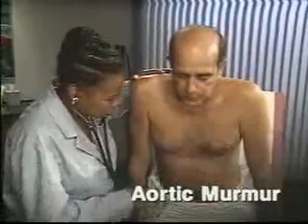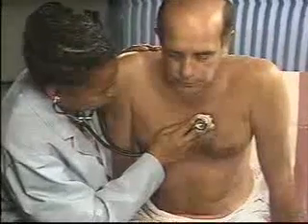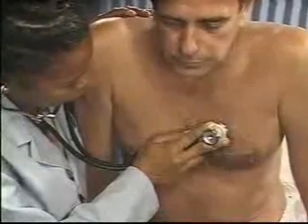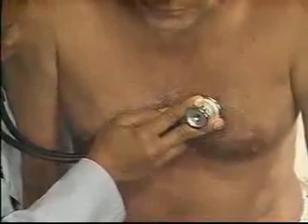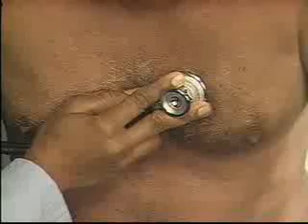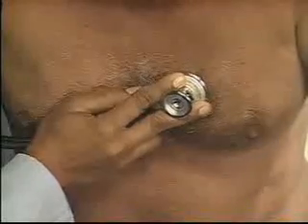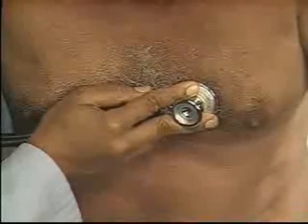To help detect aortic murmurs, especially that of aortic regurgitation, have the patient sit up and lean forward. Then ask him to exhale completely and hold his breath out. Using the diaphragm of the stethoscope, listen at the left second interspace and down the left sternal border to the apex. Breathe out completely again and hold it, pausing periodically to allow the patient to breathe.